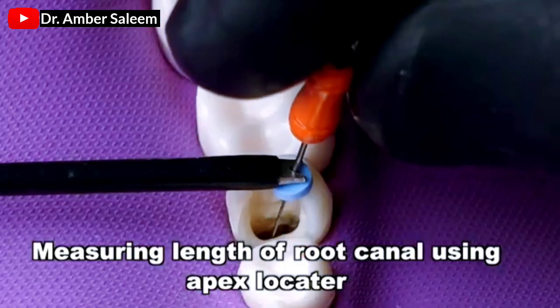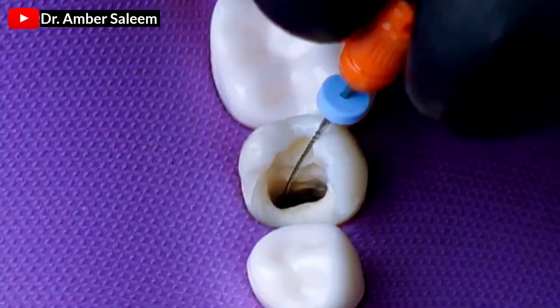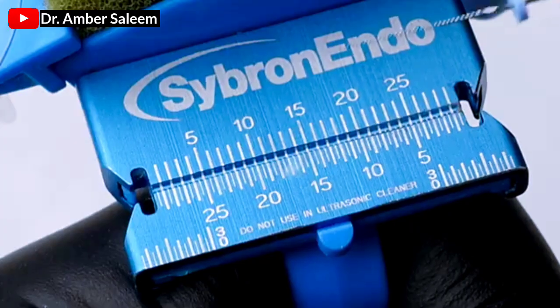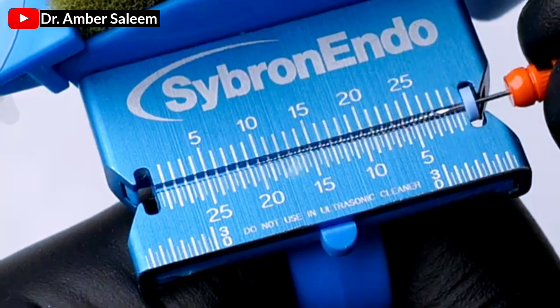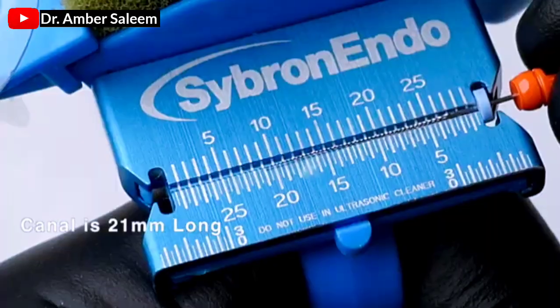Measuring length of root canal using apex locator. Canal is 21mm long.